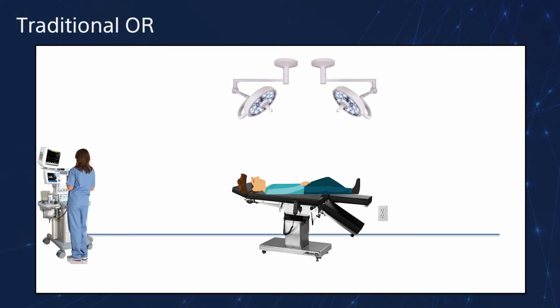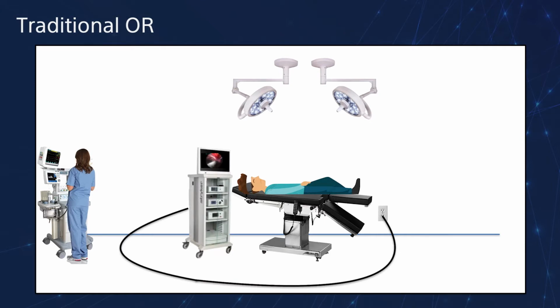So why do we need video integration in the OR? Let me walk you through that. Not too long ago, traditional ORs looked much like this one. Many procedures were open procedures where the surgeries were performed with conventional surgical instruments. As minimally invasive procedures became more popular, endoscopy equipment was wheeled into the OR on endoscopy towers, giving the surgeon a great view, but others in the room, specifically our anesthesiologist over there on the left, didn't get a great view of how the procedure was progressing.